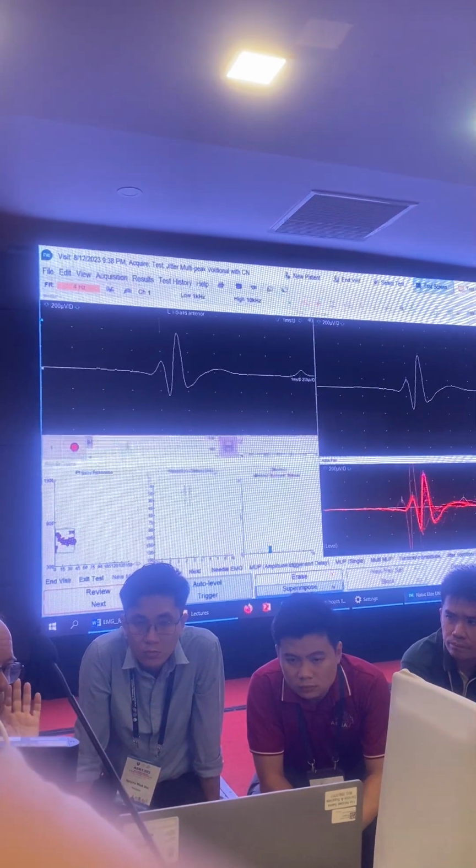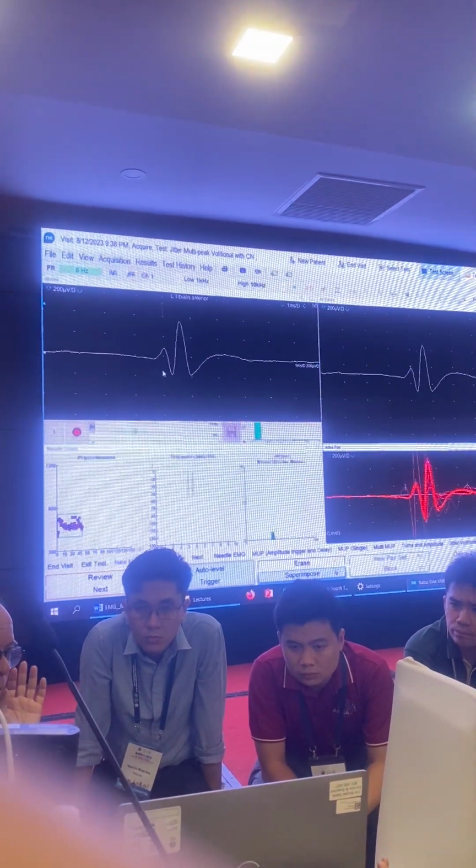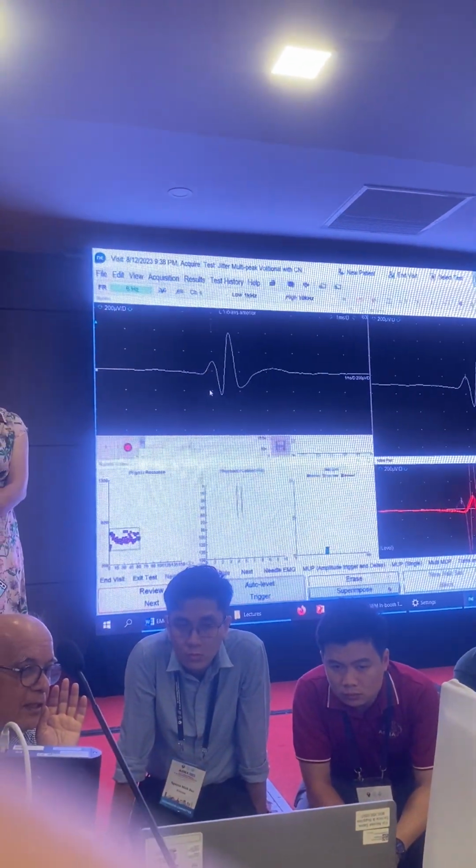See, I'm not doing anything. The machine is automatically triggering on the signals.